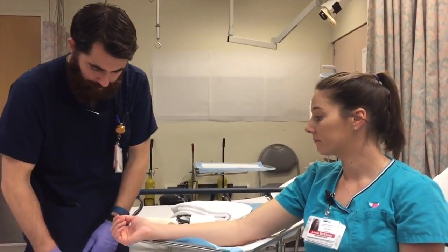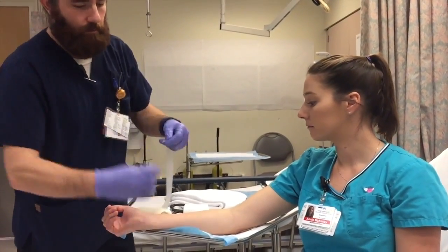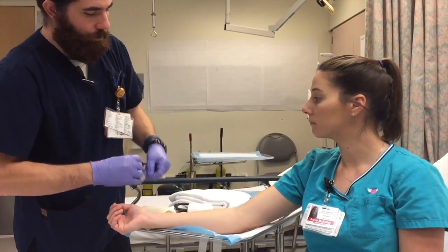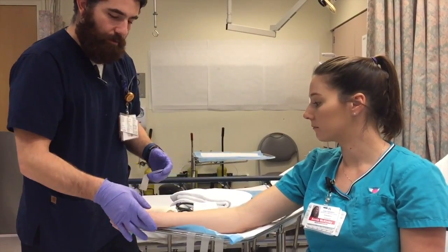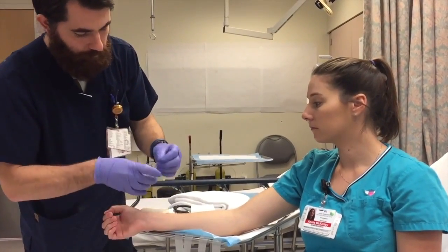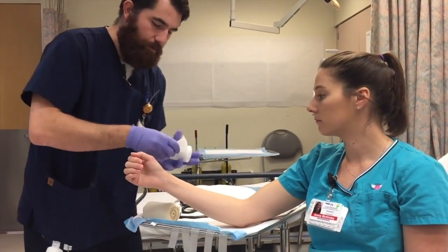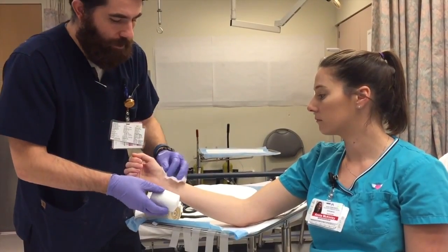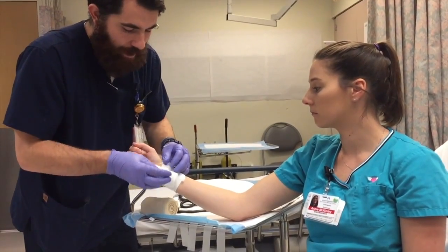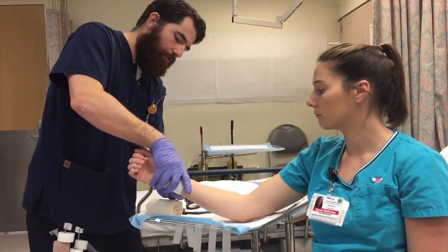So one of the things I like to do in preparation is cut my tape in advance, so I don't have to worry about doing that while the splint's hardening. Also, we will use this cotton wrap to go around any bony areas, whether it be on the leg for an ankle or around that bone here on the wrist. It doesn't need to be a lot, and you also want to be mindful of trying not to have any wrinkles in it when you wrap, because those may end up being uncomfortable later when you have a hard splint on over that.